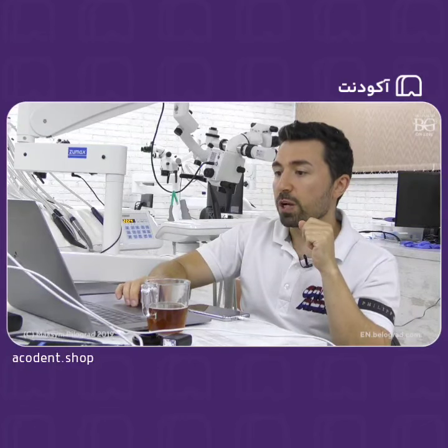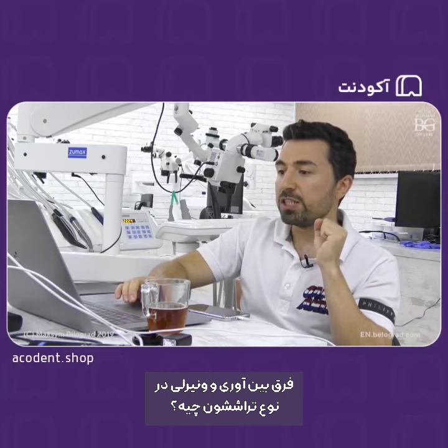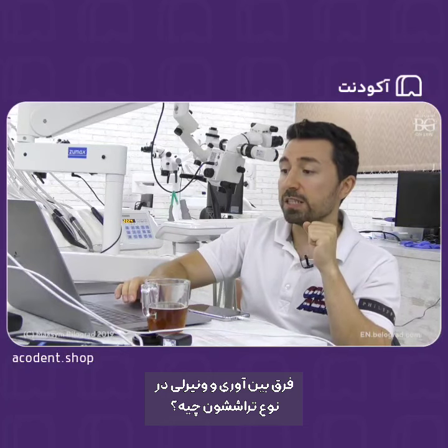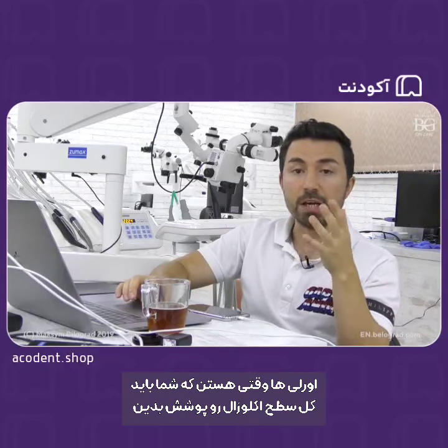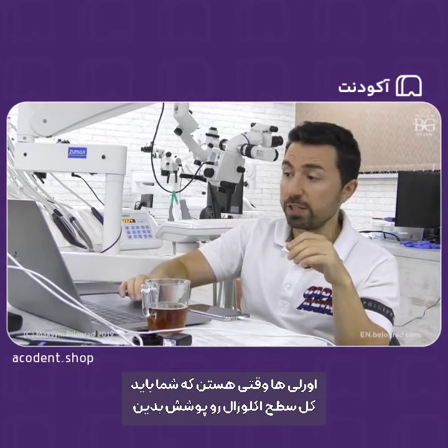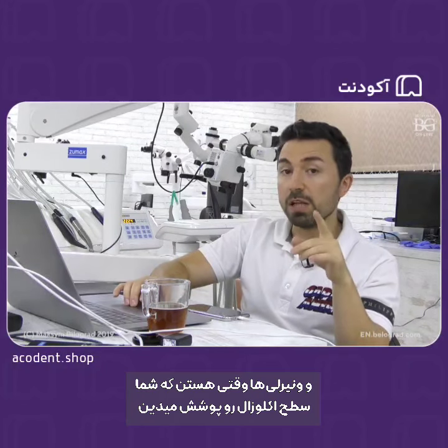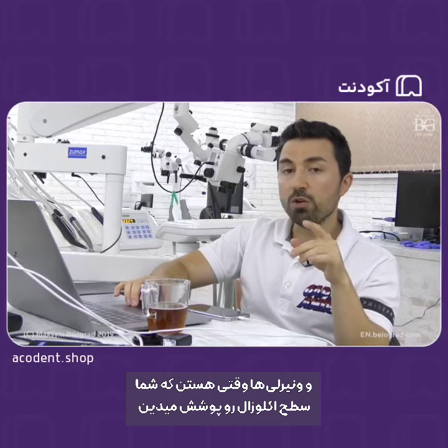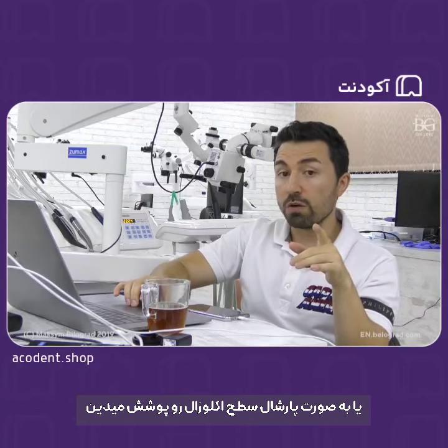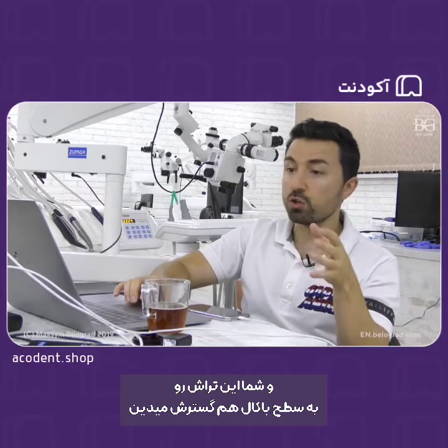Okay, the question from Sanita: how are overlays different from veneer lays in preparation? So overlay is a type of restoration when you have to cover all the occlusal surface. And veneer lay preparation is when you cover the occlusal surface or partially cover the occlusal surface and you spread your preparation to the buccal surface.